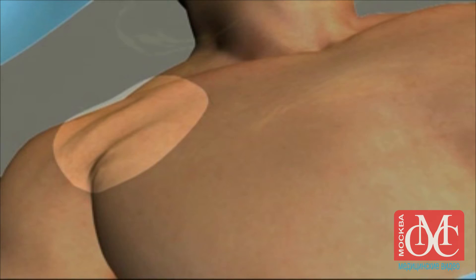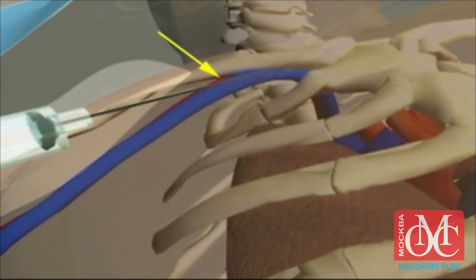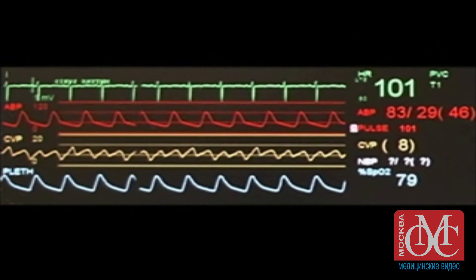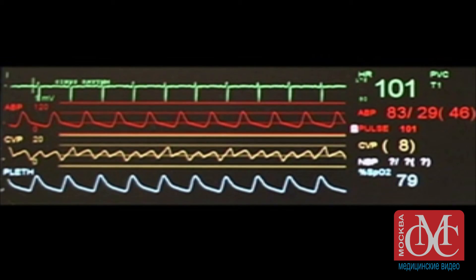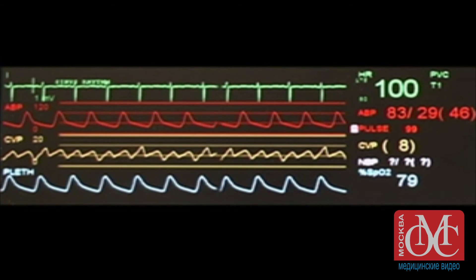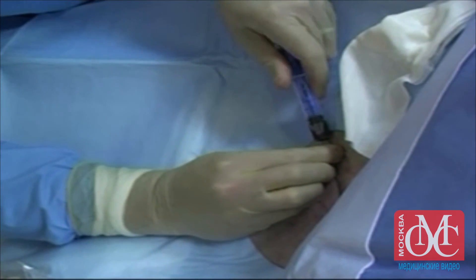There are some common problems that can occur during placement of a central venous line. Puncture of the adjacent artery is usually obvious if pulsatile or bright red blood flows into the syringe. However, in patients with hypotension, hypoxemia, or both, it may be difficult to differentiate placement in the artery from that in the vein. The possibility of this complication should be recognized before the wire is inserted.